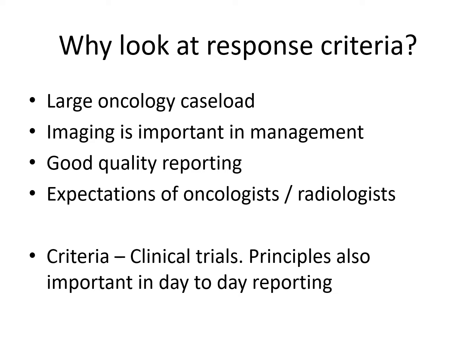Why bother? Well, in this hospital at least, we have a large oncology caseload, and many hospitals would. Imaging does play a big role in management. It does guide the oncologists, and they make their decisions pretty much based on what we tell them in our reports. For this reason, it's important we have good quality reports which help them in that process.